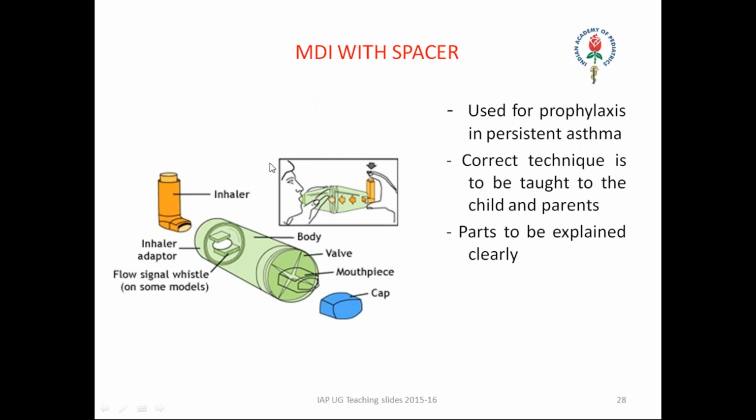So this MDI spacer, why are we attaching this? We can directly inhale, right? We can directly use the inhaler. But why are we attaching this spacer also? Because with the inhaler, adult patients can inhale correctly, but pediatric children can't take such an inspiration.